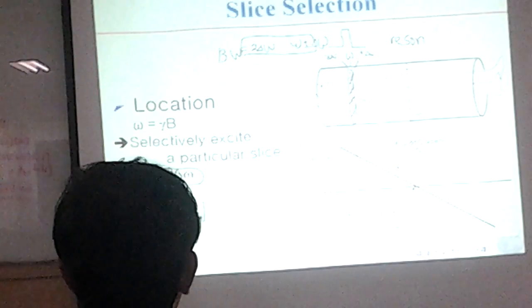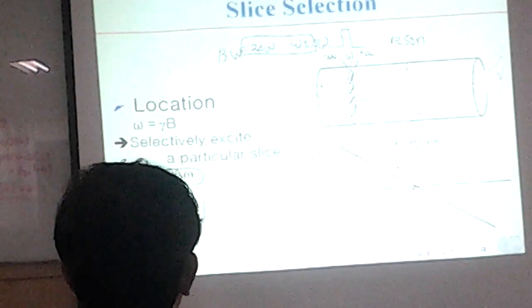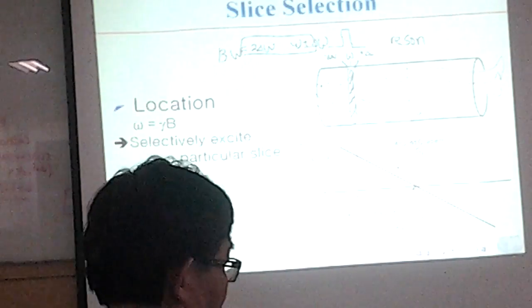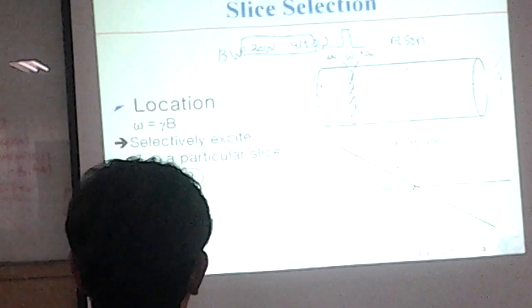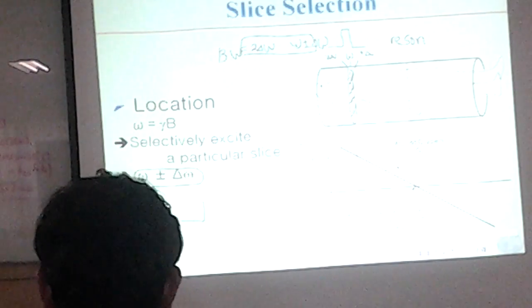So using the resonance phenomena, the desired slice is selectively excited. You got it? Only the one who matches the same resonance.